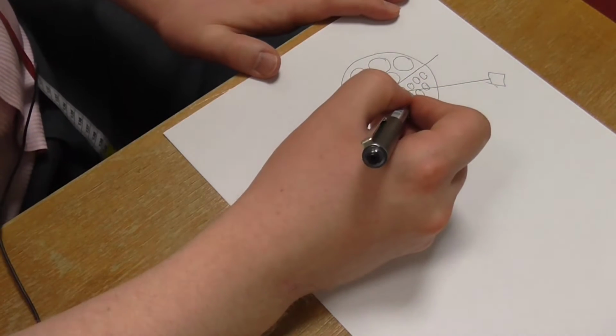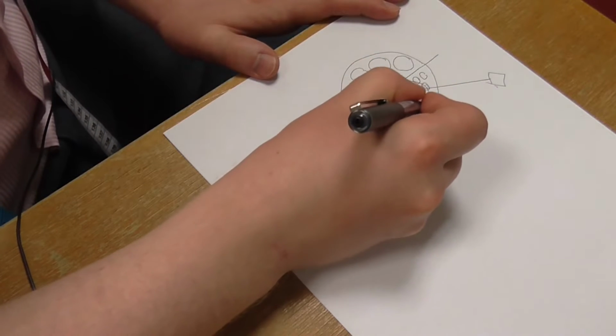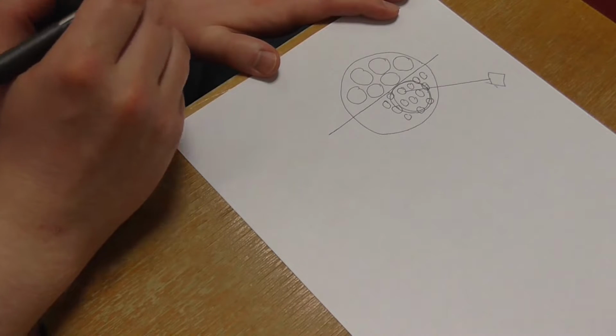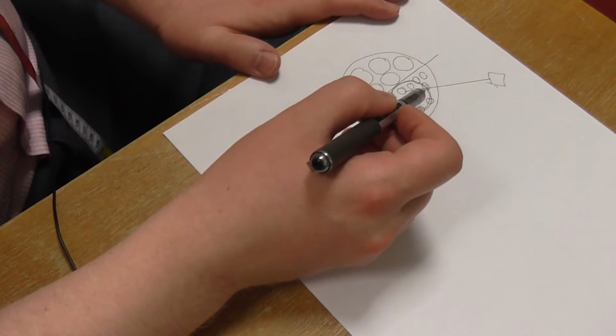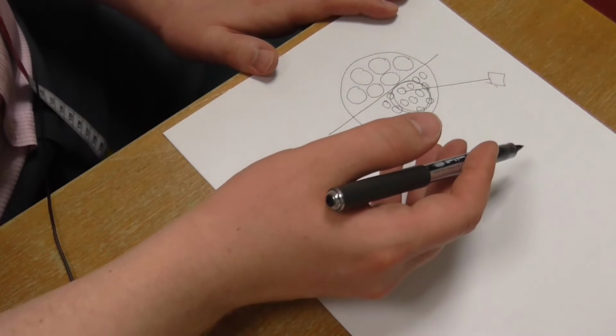In its particular field of view, it will be able to pick up lots of motor unit activity. Because the fibres are shrunken and small, they can only generate very small amounts of current.